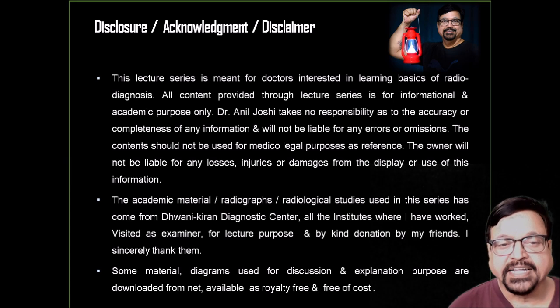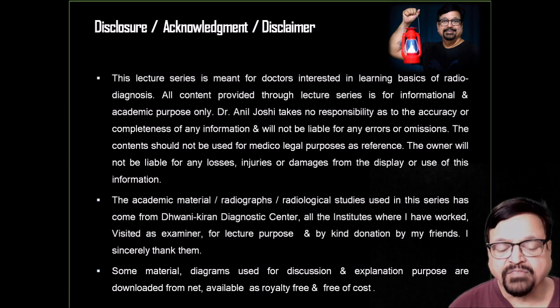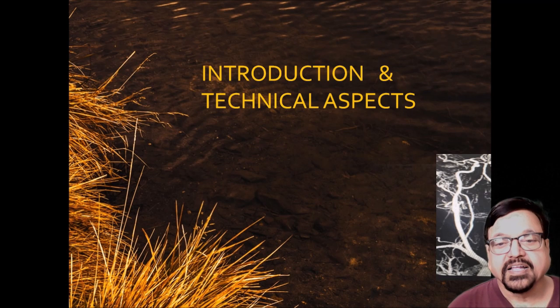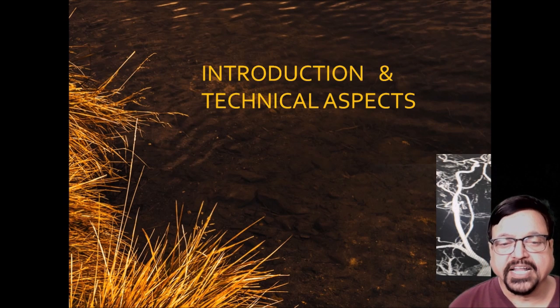We disclaim that certain material has been downloaded from the net, which is free and without royalty. Though most of the material is our own, some has come from departmental presentation work over the years. Now it is the introduction and the technical aspects of the procedure called the carotid Doppler.